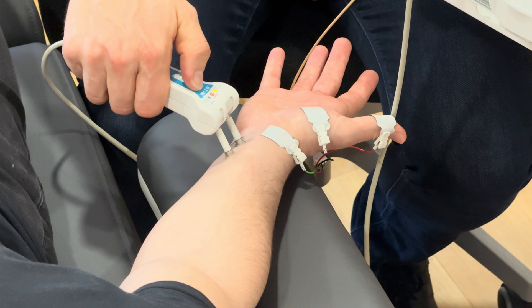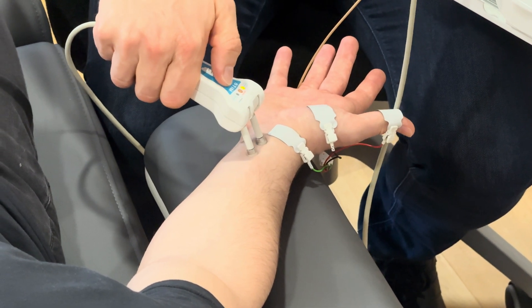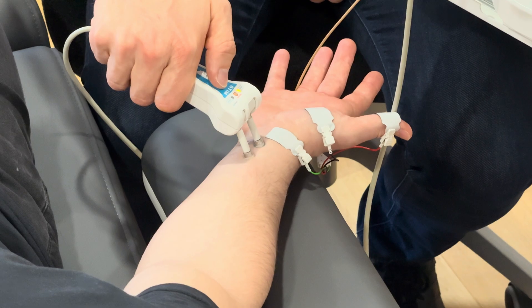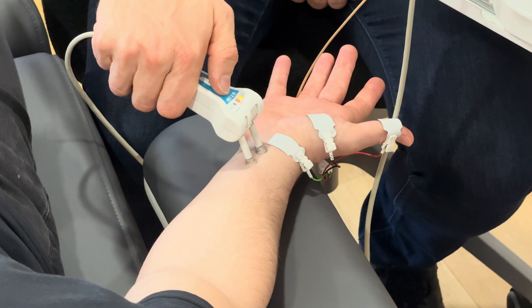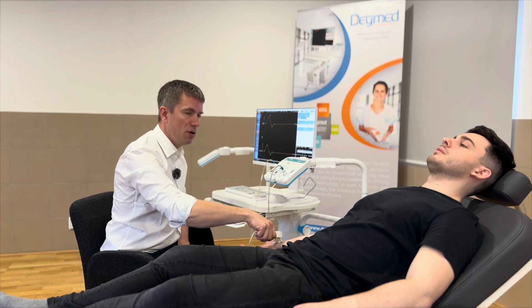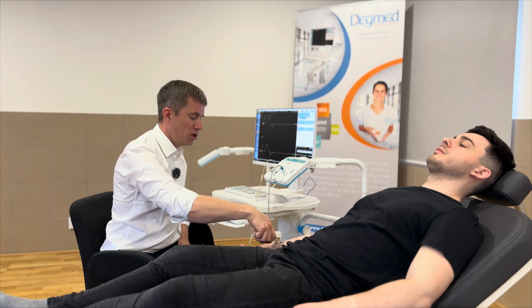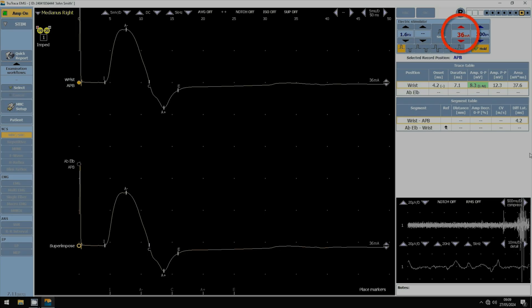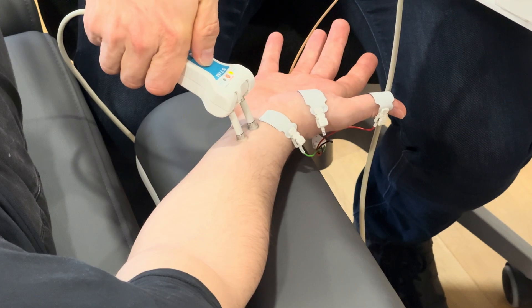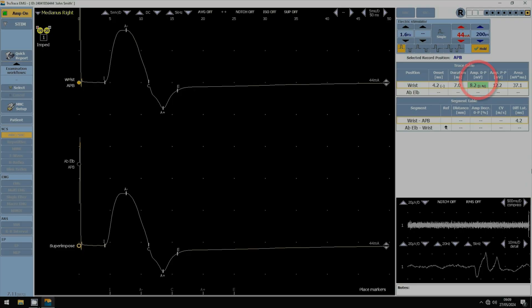I go a little bit to the side — the response disappears — and I go a little bit to the other side. Over here I am exactly over the median nerve, and at a stimulation of 22 mA I get a base-to-peak amplitude of 5.4 mV. To be sure I have a supramaximal answer, I increase the stimulator intensity a little without changing its position, watching whether I get a higher compound muscle action potential. I increase a little bit more and the amplitude remains the same.